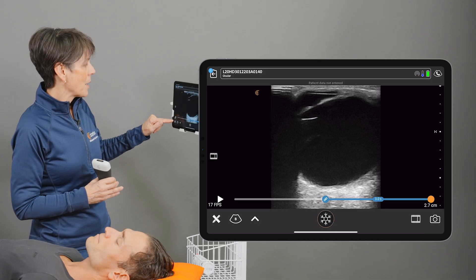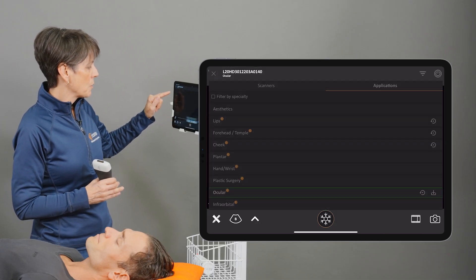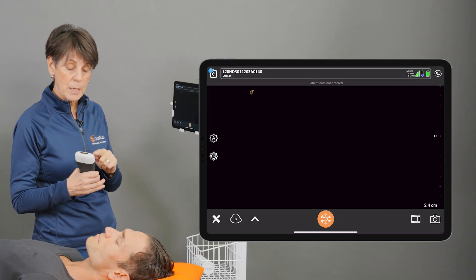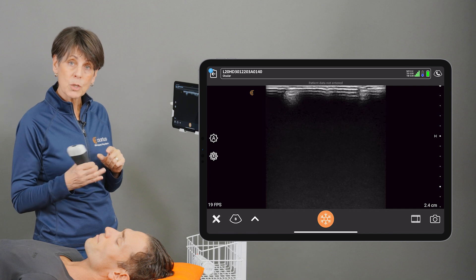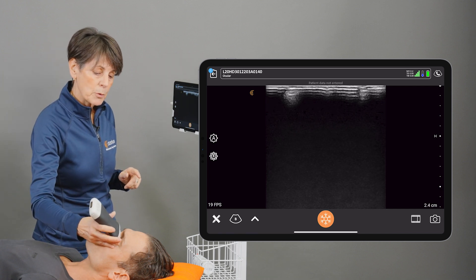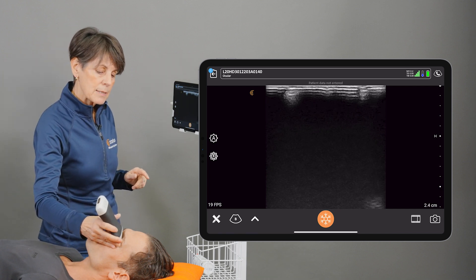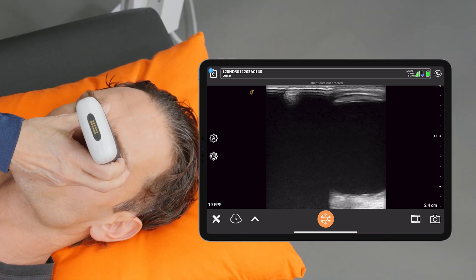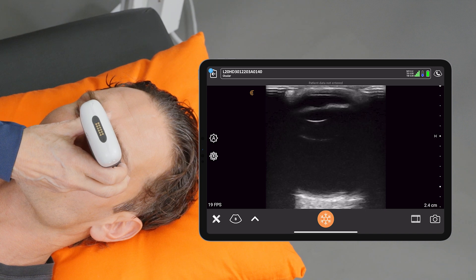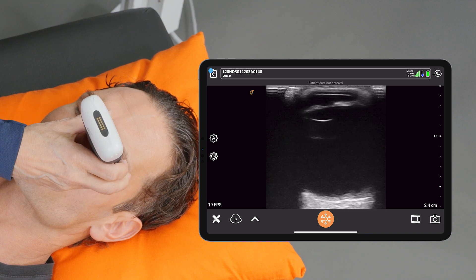I've gone into the ocular preset and I'm using the L20 scanner. I'm going to place the scanner on the patient's eye and just have them look straight up and down.